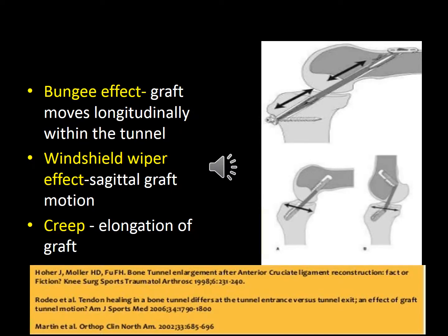The graft is subjected to different kinds of motion after suspensory cortical fixation. Bungee effect: when the graft moves up and down, it is a bungee cord effect. Windshield wiper effect: it is a sagittal graft motion, and creep is elongation of the graft after fixation.